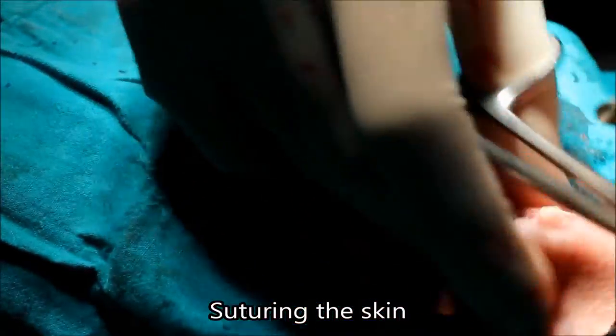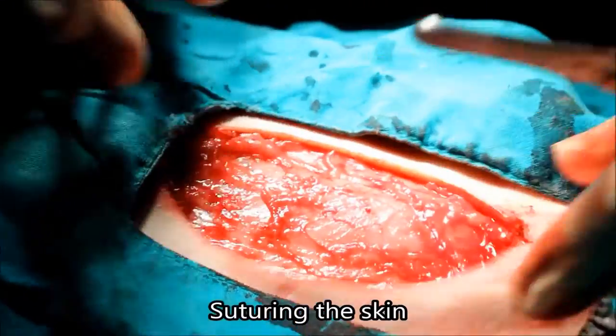The vet separates some skin from the abdominal fascia to allow the skin to stretch over the wound.